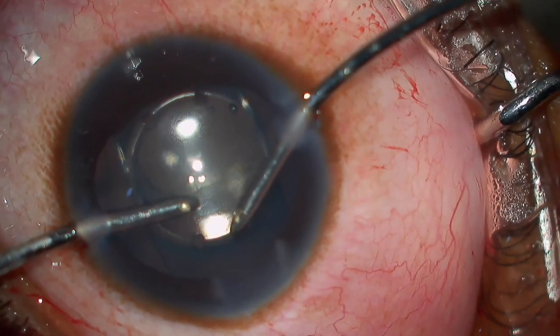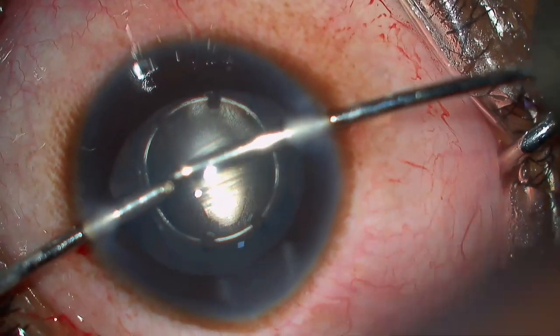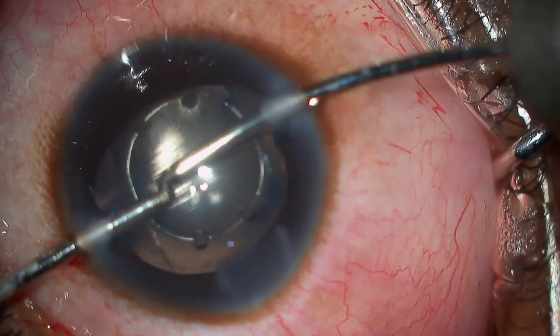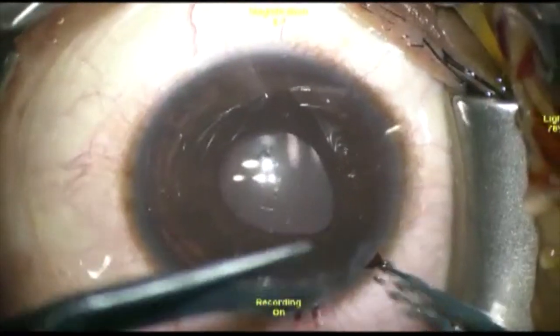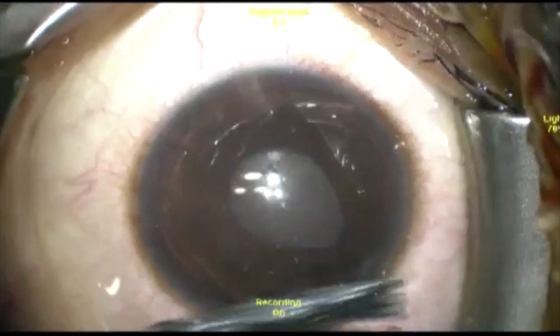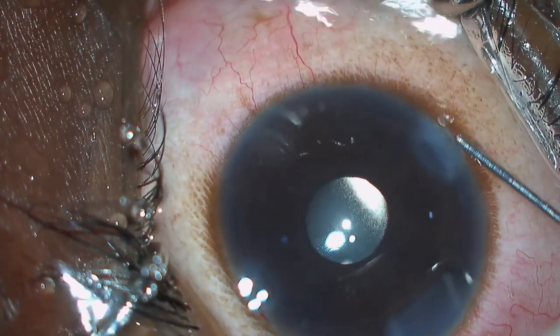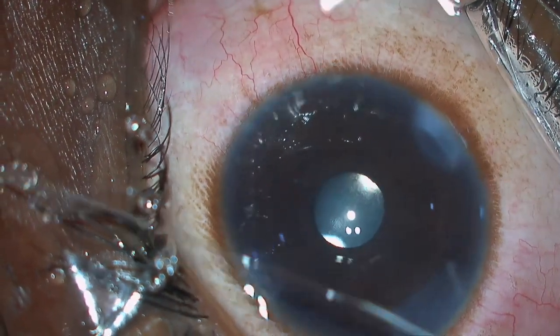Spend a lot of time — a minute or two — to wash the viscoelastic out completely from the anterior chamber, from the angles, and as much as possible from between the lenses. Peripheral iridectomy is an option depending upon the surgeon's comfort. All the ports are hydrated and the tension of the eye is checked.